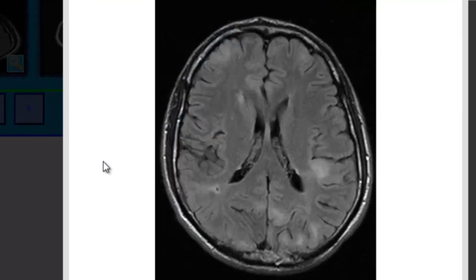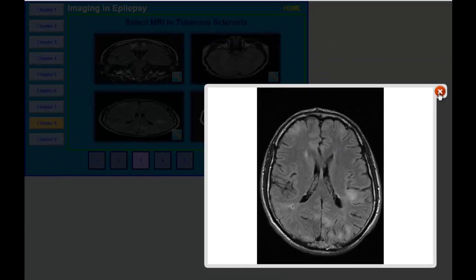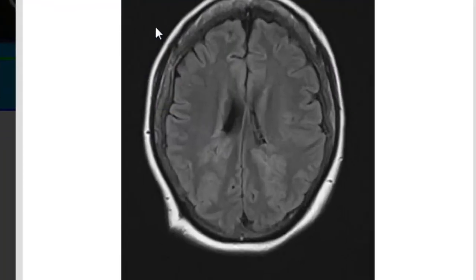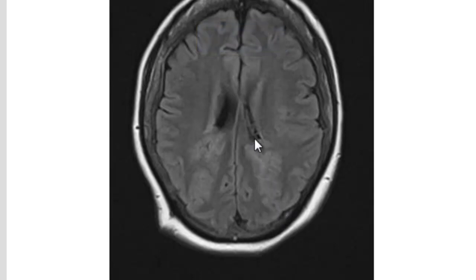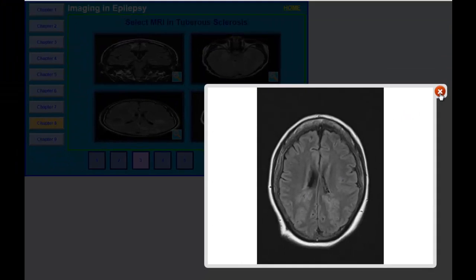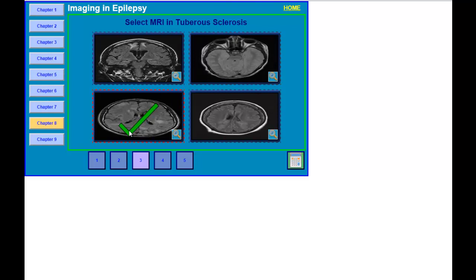Looking over here, you can see multiple tubers in different areas. This MRI is quite characteristic of tuberous sclerosis, which is an autosomal dominant condition that can have multiple cutaneous manifestations as well as characteristic MRI findings. The last image shows schizencephaly — you see an abnormal gray matter lining in both areas that connects the surface all the way to the ventricle. Those are four different pathologies associated with seizures, but the correct answer for tuberous sclerosis is this one.